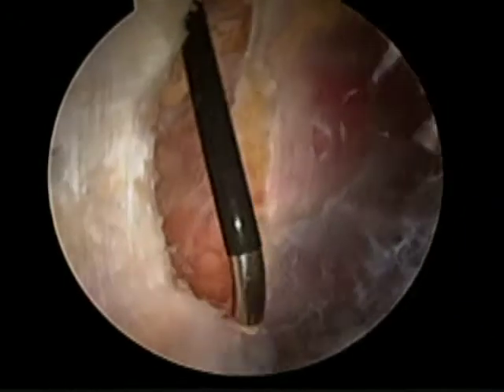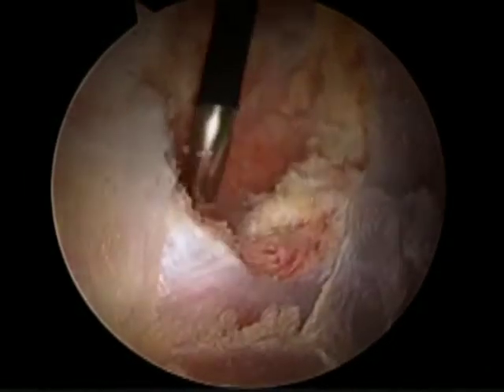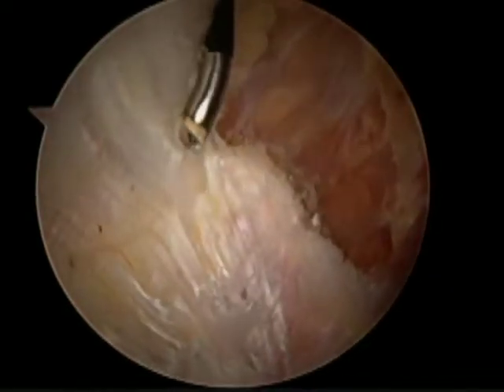We're sure to cut sufficiently posteriorly that we address all of the longitudinal fibers of the IT band, and we discontinue the cut where the gluteus maximus muscular insertion begins.